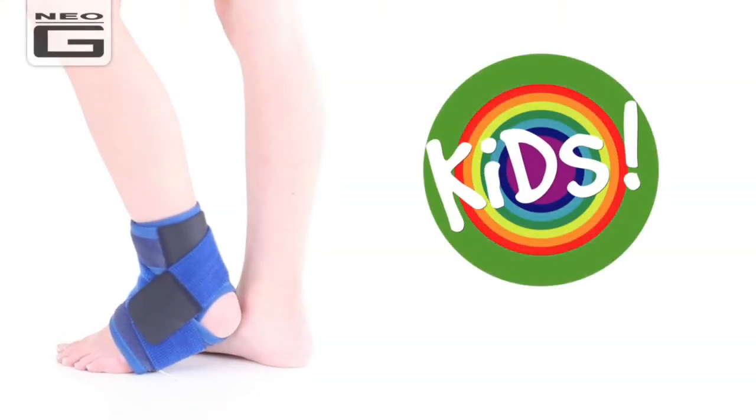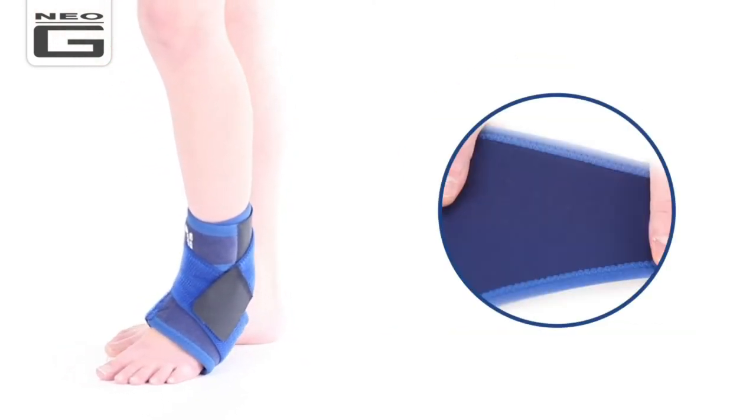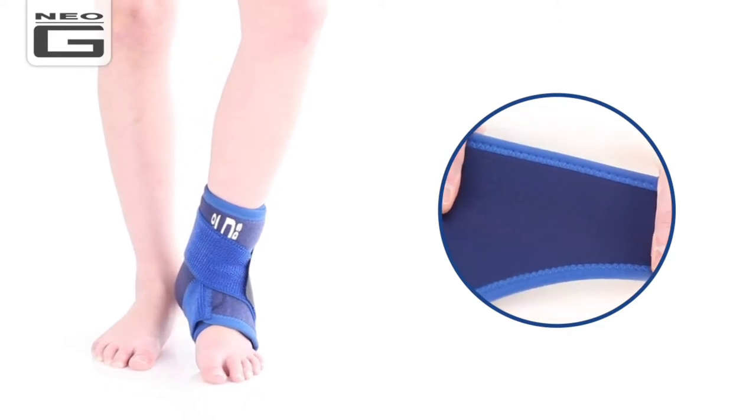The Neo-G Kids Ankle Support with Figure of 8 Strap is specifically designed for the younger wearer and offers moderate support. The durable, heat-therapeutic neoprene helps warm muscles and joints, helping with arthritic ankles and chronic aches and stiffness.